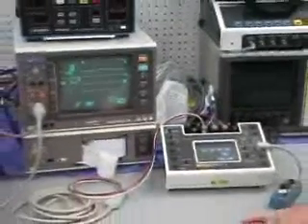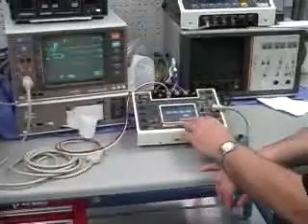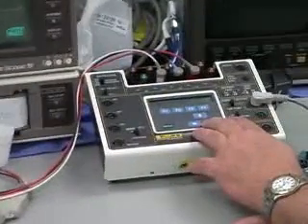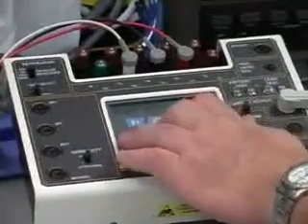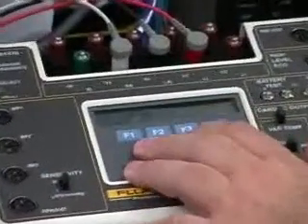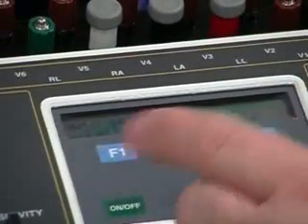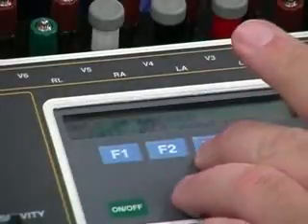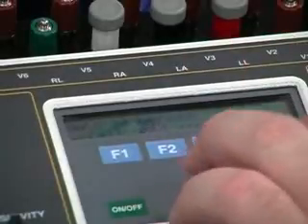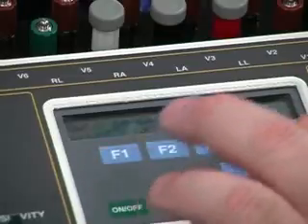Yeah. So there are a bunch of those in here, and this allows you to tie a lot of these different selections together. There's a ventricular series which goes through a wide range of ventricular arrhythmias, conduction defects or respiratory changes, and just a whole different series of things you can do.